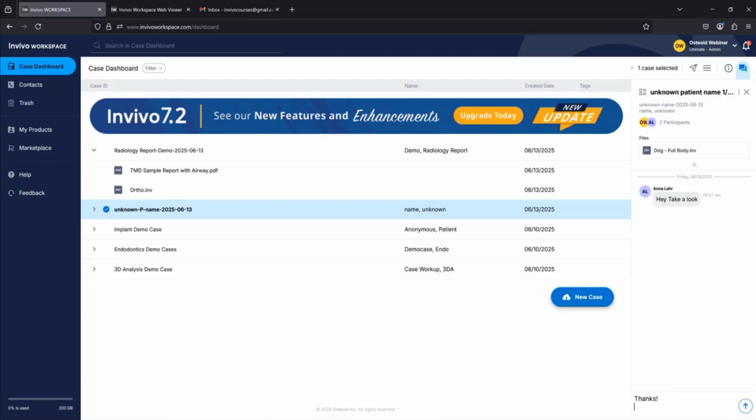Now, in terms of being notified of these replies here, it's usually via email. So you'll get an email notification saying, hey, Anna has replied back to your discussion, take a look, and you'll be prompted to sign back in and view that discussion there. So everything is encrypted until you are right within the platform itself, so you're not able to access those messages from the email.